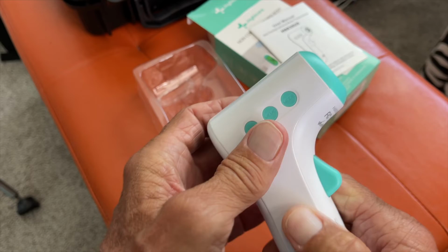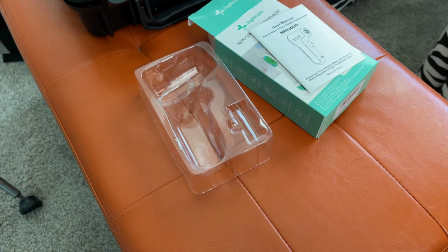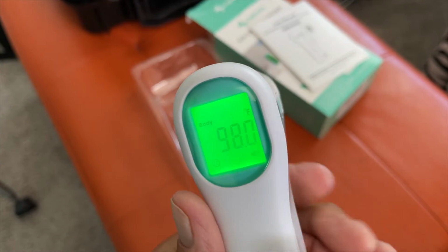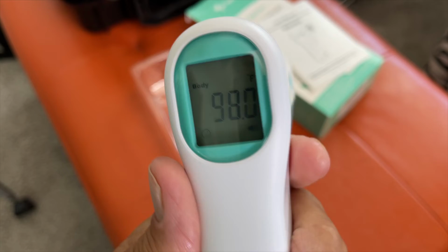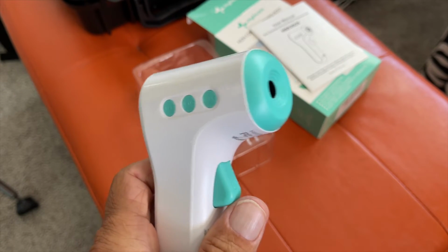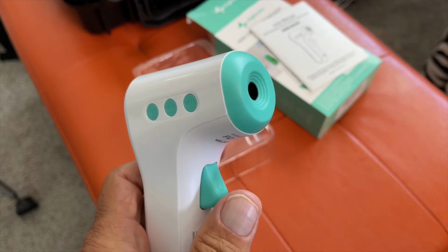So I'm just going to point it at my head and shoot it right in my head. Here we go. Okay, there we go. I'm 98. So I'm a little colder than an average person. But yeah, it works for sure. You got to get it close to your head. So maybe I'll show you that.